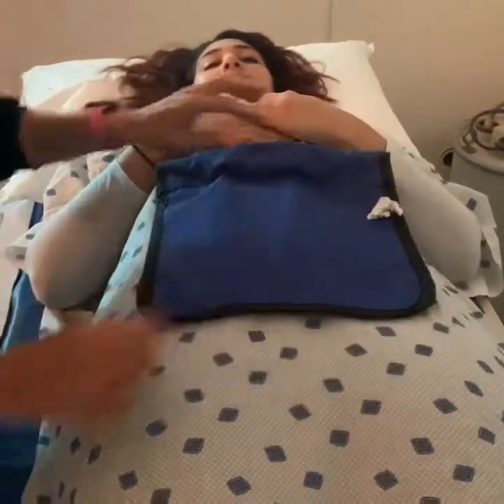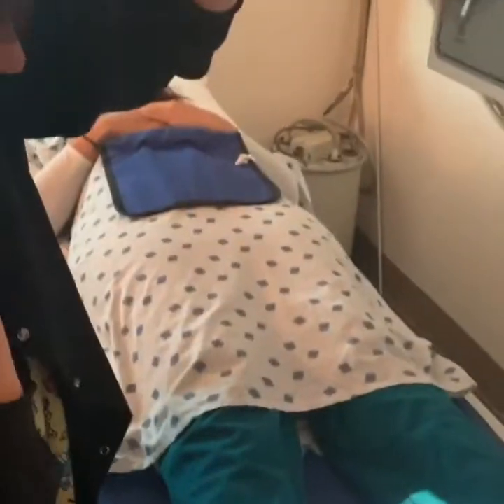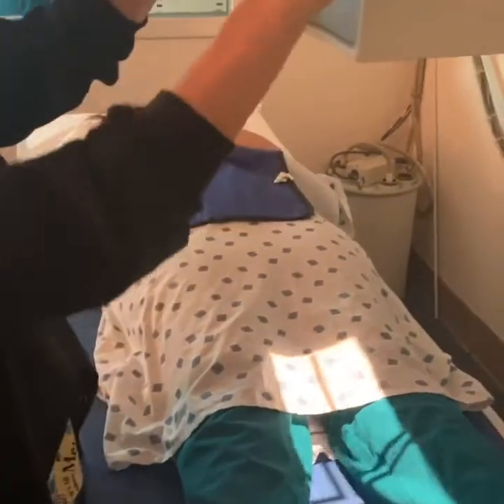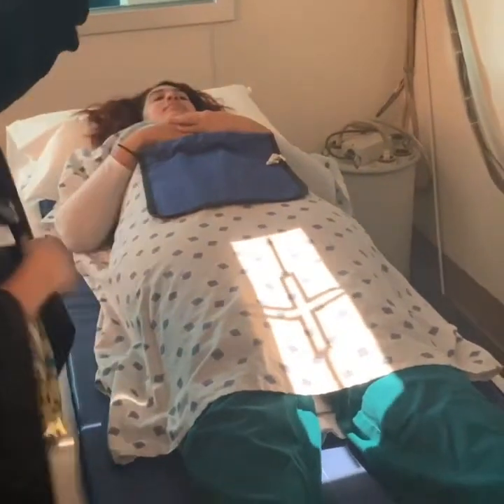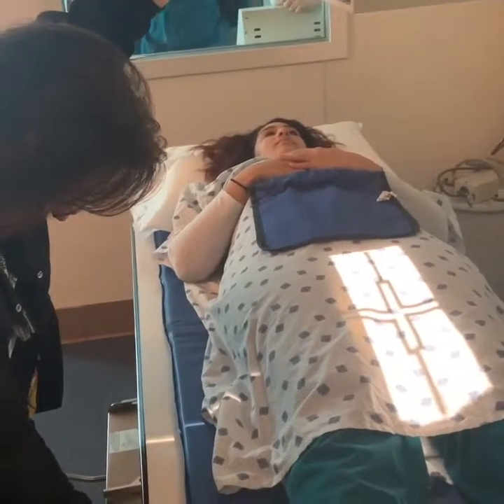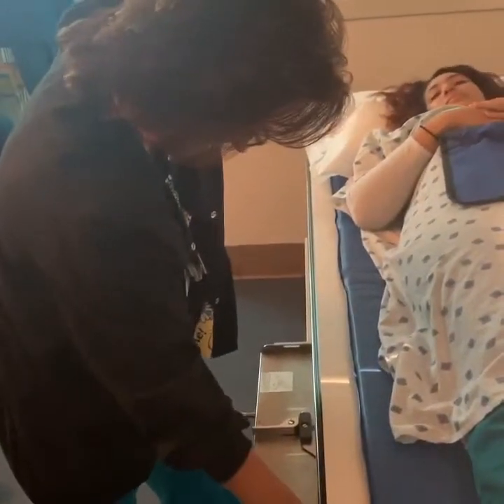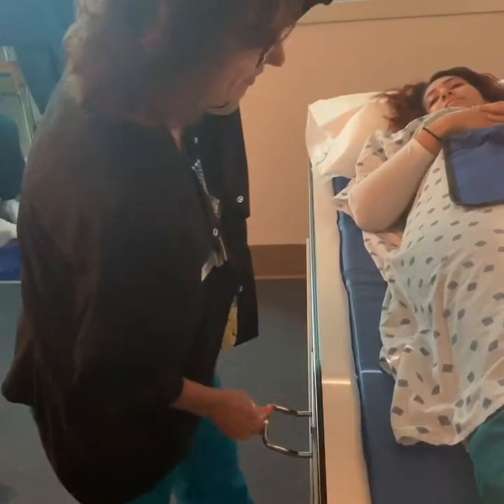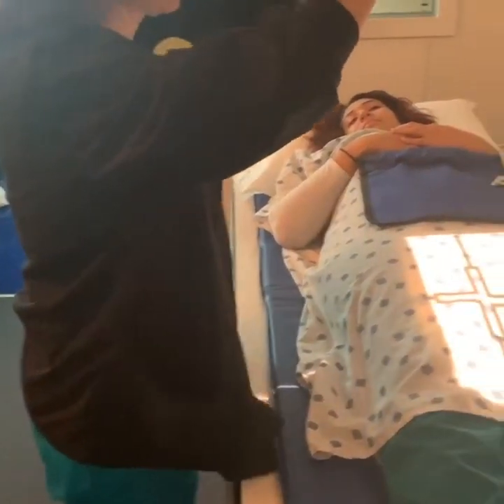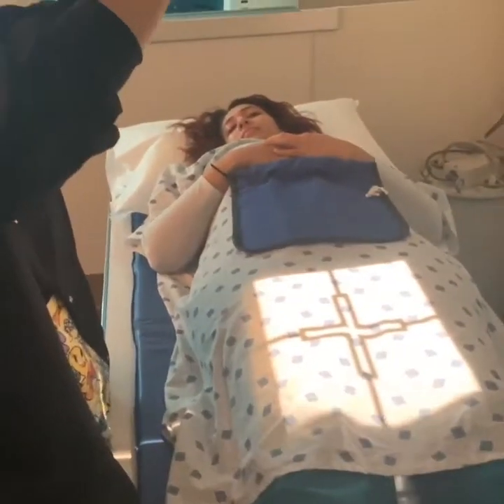Okay. All right. So we're going to put this shield on you. We said it was right leg. Now we have to include both joints. So what we're going to do, make sure we're in detail. We're at 40 inches to the bucky. Make sure we're aligned. All right. And we have a 14 by 17 in there.